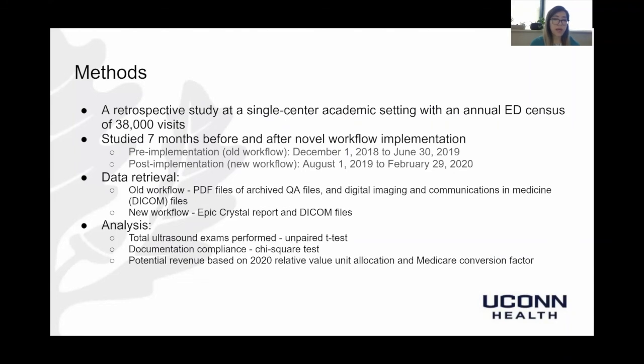The study took place at an academic emergency department that sees 38,000 patients annually. We retrospectively looked at the 7 months before and after July 2019, when our novel workflow was implemented. In the old workflow, all POCUS exams were manually archived in the form of DICOM files, and interpretations with QA data were saved as PDF files.